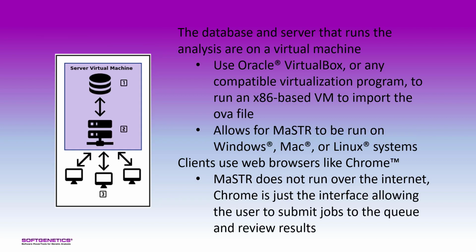The database and server are housed on a virtual machine, like Oracle VirtualBox. This allows for MaSTR to be run on Windows, Mac, or Linux systems. Clients use web browsers like Chrome or Firefox as the interface to submit jobs and review results. However, it's important to note that MaSTR does not run over the internet. It runs locally over your internal network.